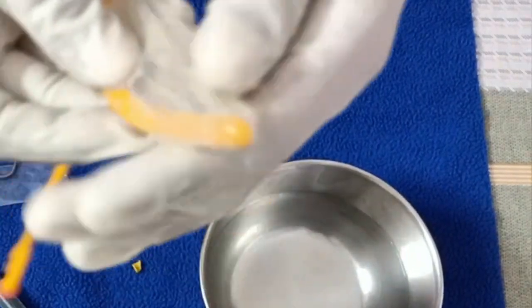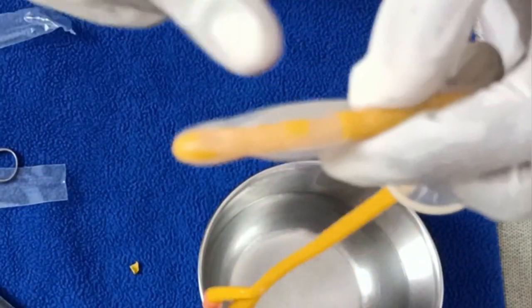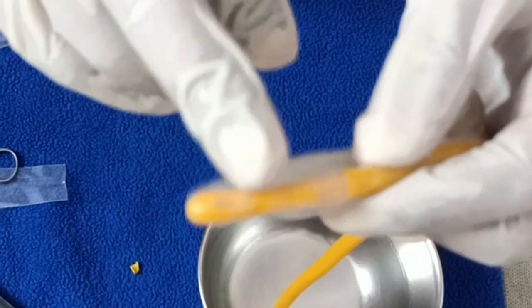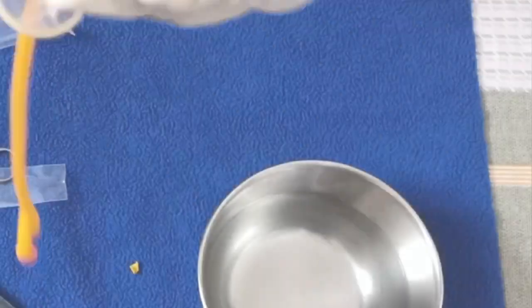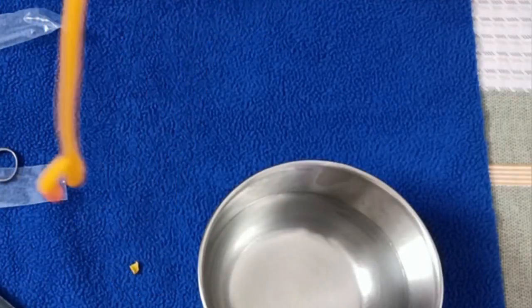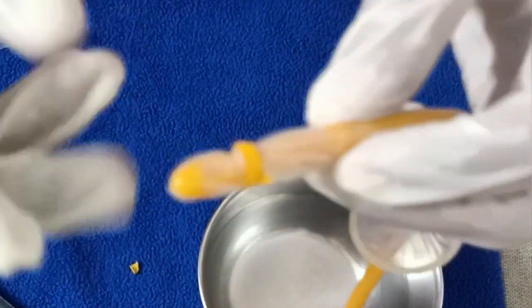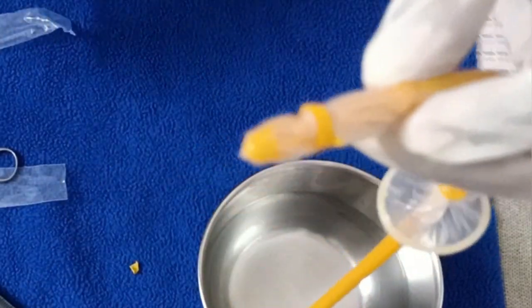Now coming to the other end — the next ring is placed between the excised balloon and the catheter here. I have now effectively placed it between these two points. Next, you cut the tip of this balloon.